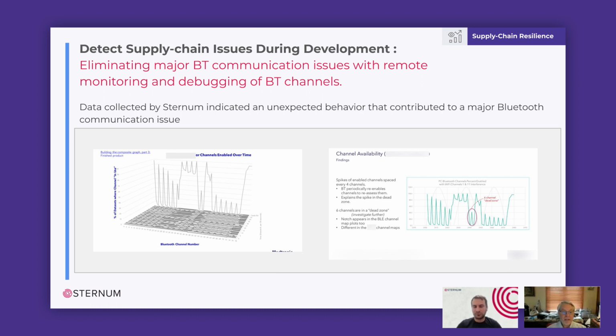And by having this kind of data collected from the field, we can take a look at what the real operating conditions were at the time whenever a problem does show up, and not worry about sending a team out there to hopefully be able to catch it. It's like remote debugging. I like to think of it as spying on the Wi-Fi environment, or on the noise environment for Bluetooth. With much less equipment, I guess. Yep, it's built into the equipment we already have.